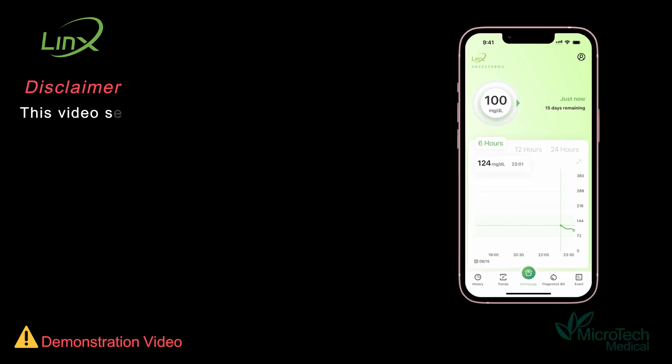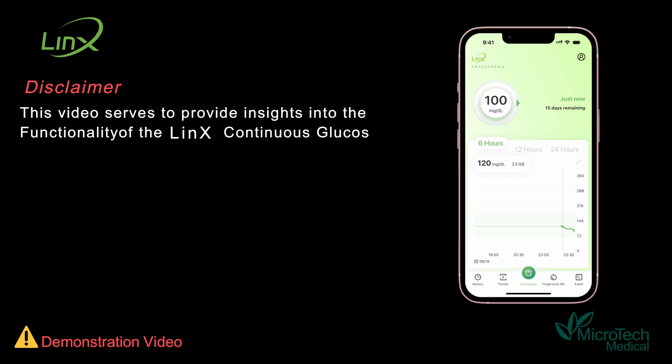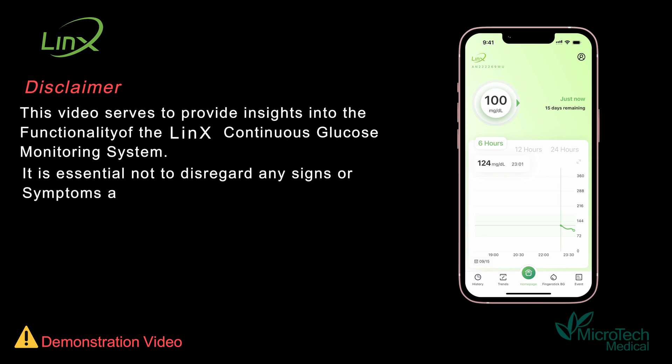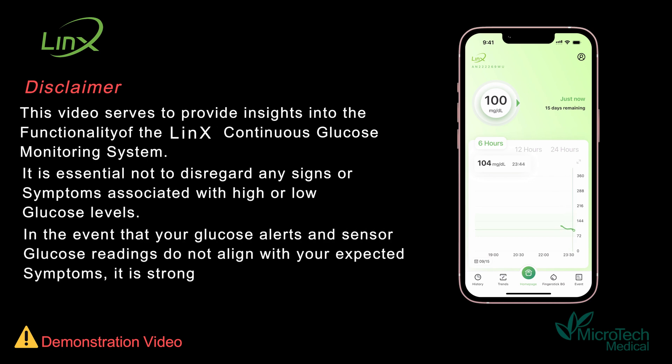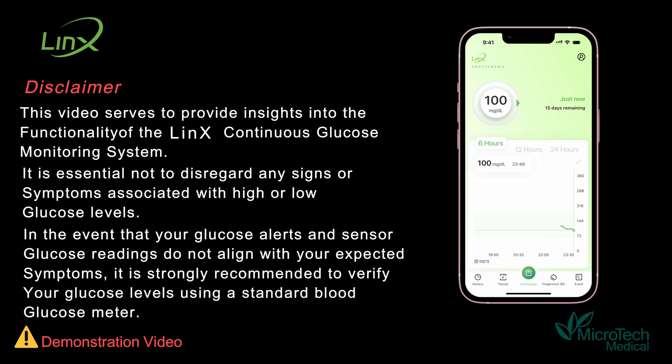This video serves to provide insights into the functionality of the continuous glucose monitoring system. It is essential not to disregard any signs or symptoms associated with high or low glucose levels. In the event that your glucose alerts and sensor glucose readings do not align with your expected symptoms, it is strongly recommended to verify your glucose levels using a standard blood glucose meter.